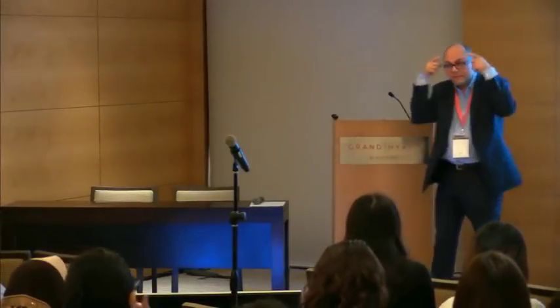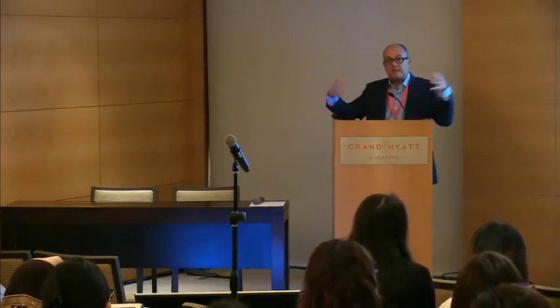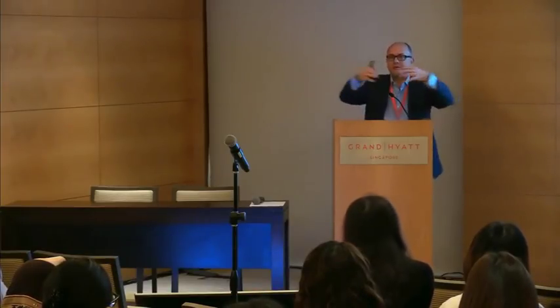So we can estimate the weight of the baby by combining the measurements of the head, of the abdomen, and of the femur length, and we put it in a formula that estimates the weight. But please remember that this is an estimation, because the measurement of the head has an error, and the measurement of the AC has an error, and the measurement of the femur has an error. And when you do an estimated fetal weight, you are multiplying all the errors as well.